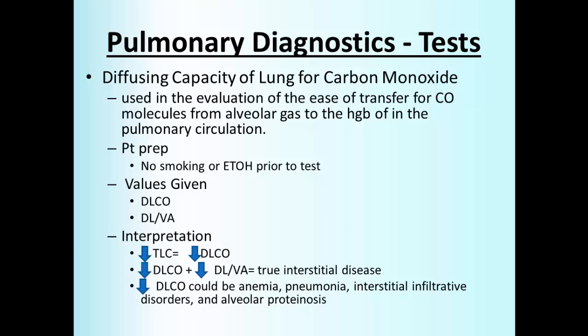Reported parameters typically include the DLCO and the diffusing capacity of the lung to alveolar volume, the average inspiratory vital capacity, or IVC, up to reproducible measurements, and the average calculated alveolar volume, or VA, and hemoglobin-corrected and carboxyhemoglobin-corrected values.